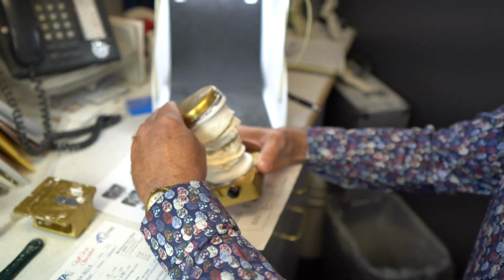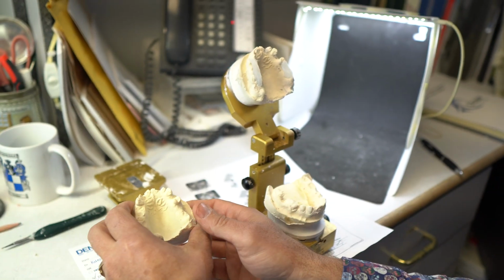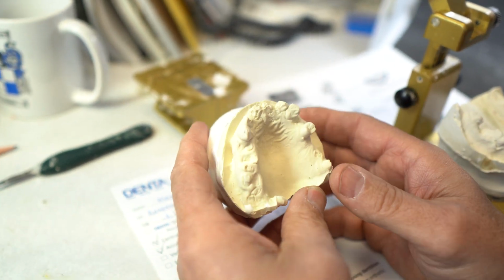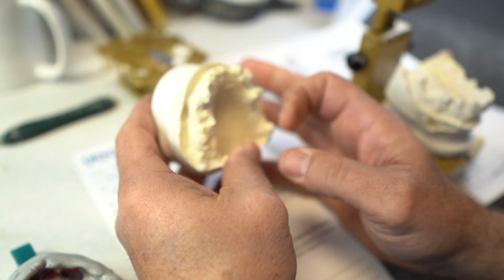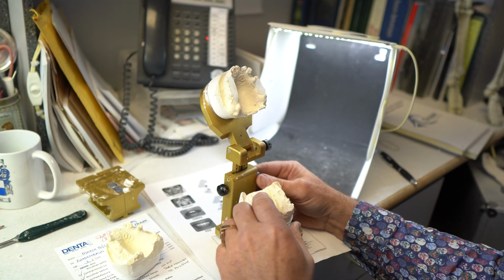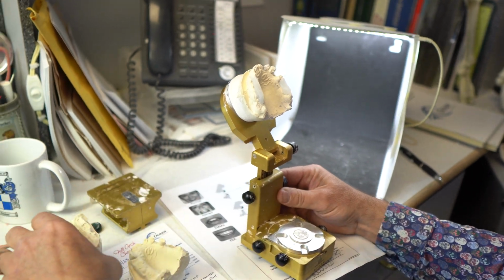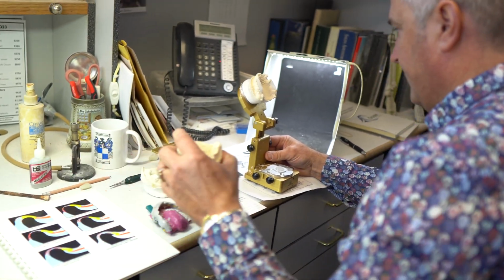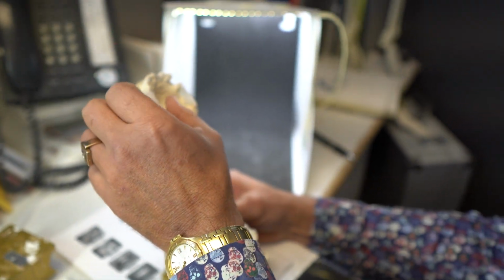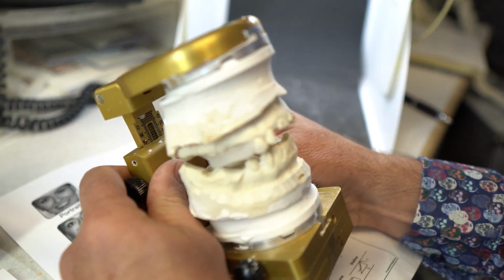Ultimately, we have all sorts of cases that come in and that require new VDOs. Now, this happens to be a case that's going to be an immediate denture on the upper, and on the lower, we've had instruction that this will be an acrylic partial. Okay, now this patient, when I show you the actual bite, you're going to identify really, really quickly that this patient will require an opening, and I'll show you where I'm going here.